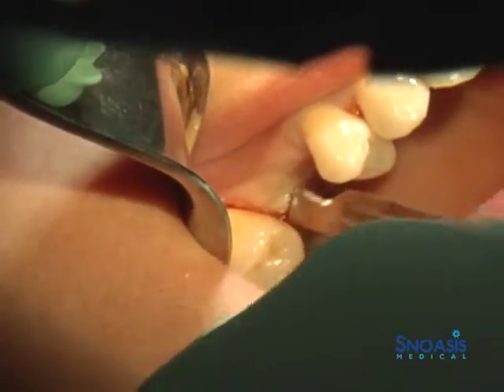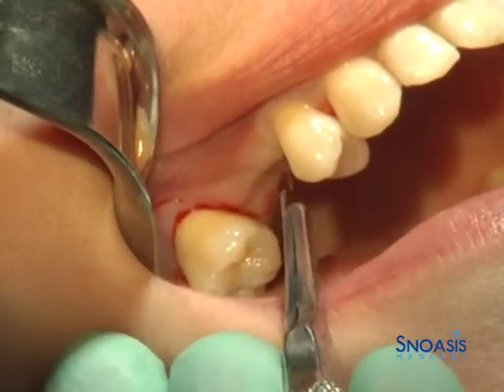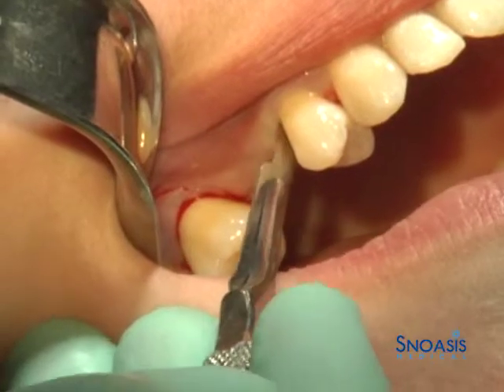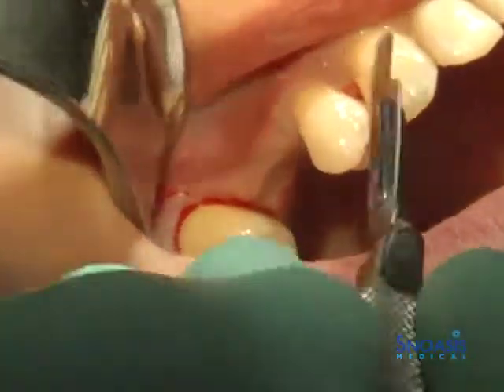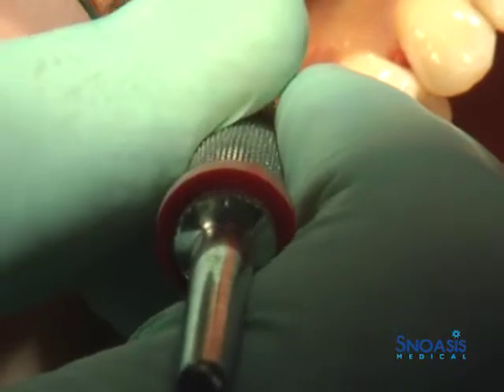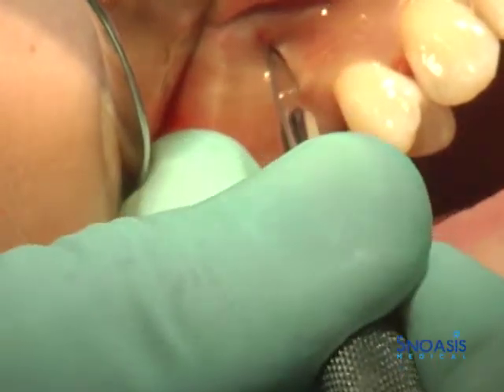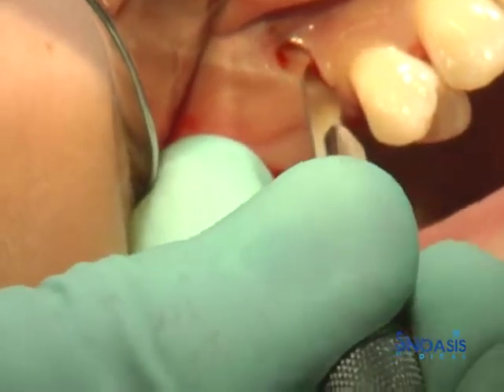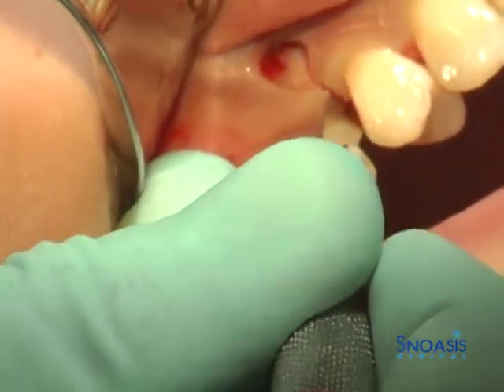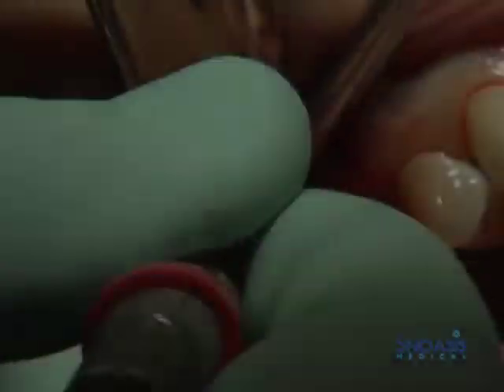the patient has a full-thickness trapezoidal mucoperiosteal flap elevated in the area of tooth number four. Full-thickness flap reflection is accomplished past the mucogingival junction to expose the lateral wall of the maxillary sinus.